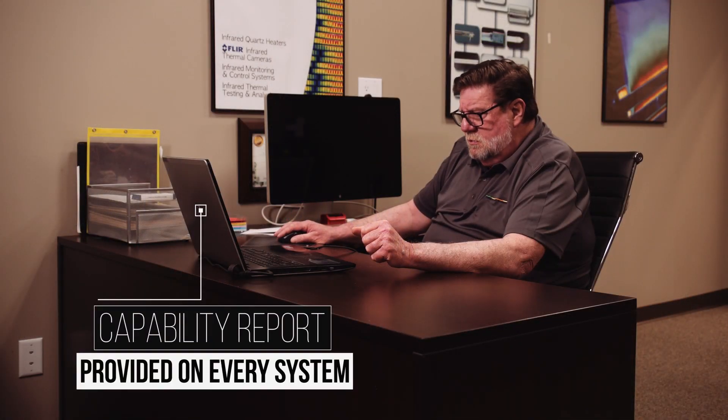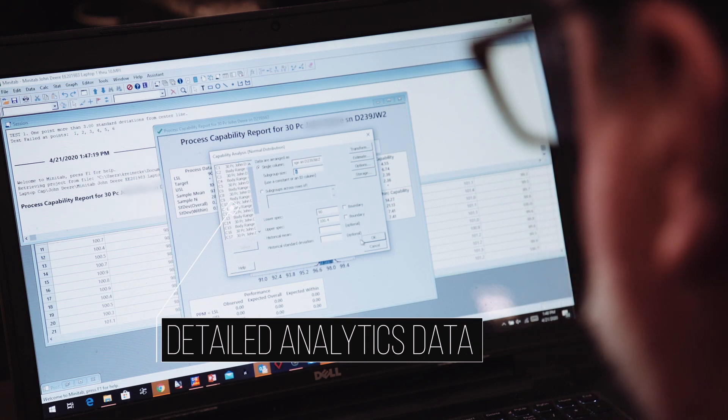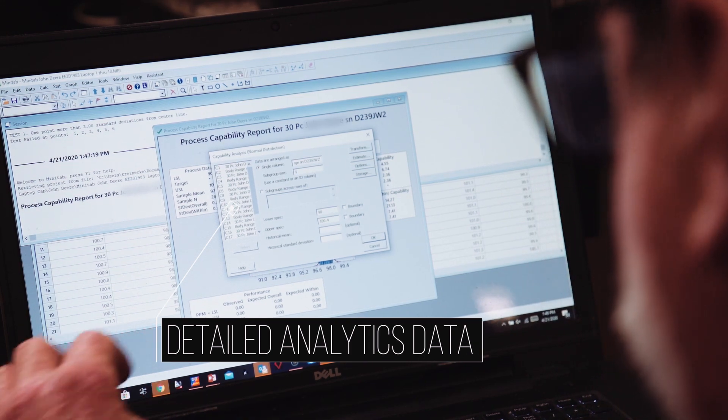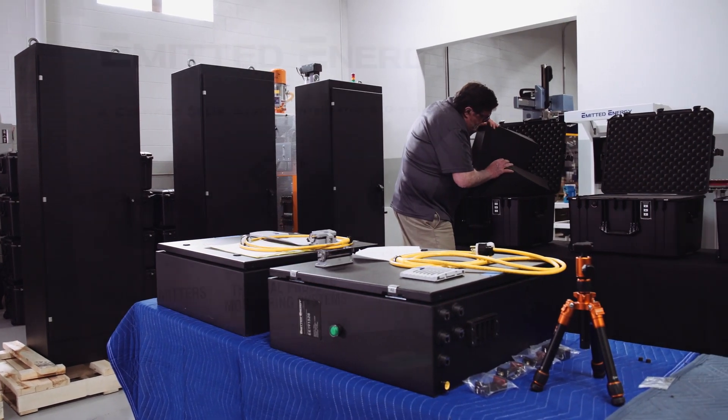In addition, the Advisor stores the temperature data so you can access information on how many good versus bad scans per day. This data will help understand and prepare for seasonal illness. The Advisor is Emitted Energy's long-term solution to today's manufacturing challenges.